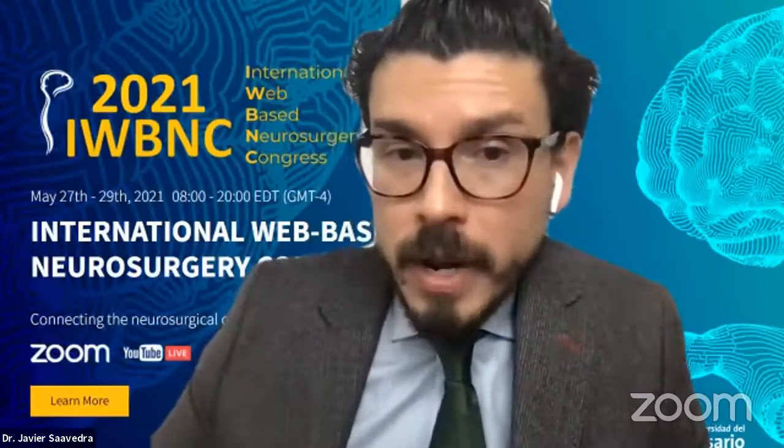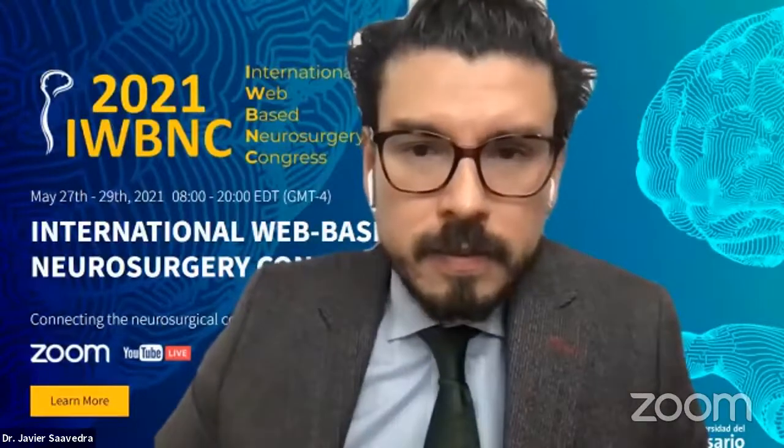Okay, thank you. The next one is related to brainstem lesions. What is the role of TONES in the treatment of brainstem lesions? Well, I haven't seen and I haven't read any paper on that. As you could see on the images, you have a wide access to the lateral face of the brainstem, and as you could see in the last paper I showed, you can go transtentorial. But I haven't read any paper on that. I think it's possible.